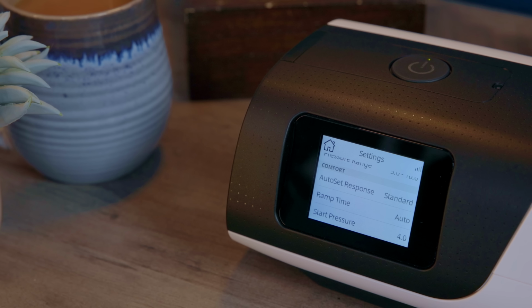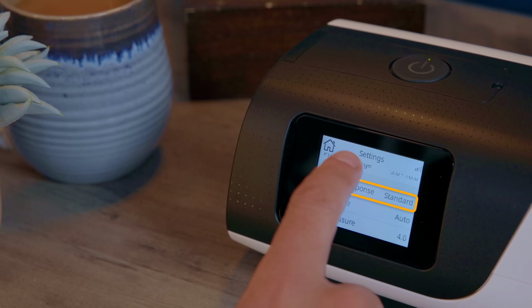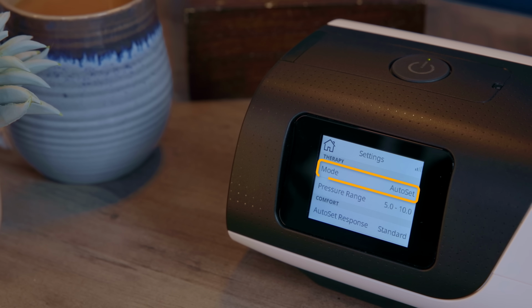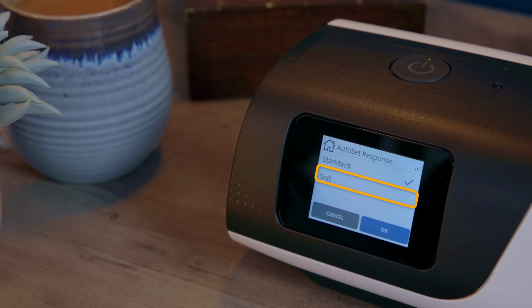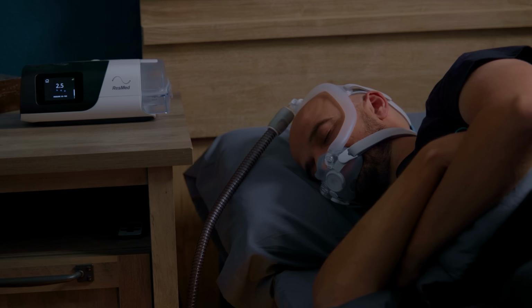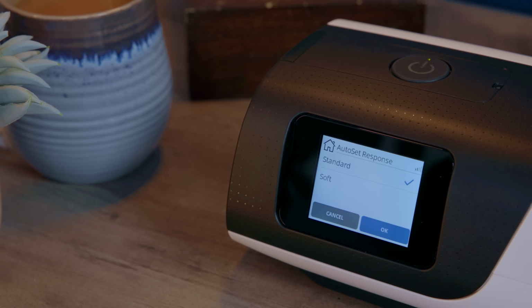The first setting here is AutoSet Response, so long as you have your machine set to the AutoSet mode, which will be most people. AutoSet Response is not in the normal My Options menu. It has two options, Standard or Soft. Standard means that the algorithm will increase and decrease the machine pressure at the standard rate, which is designed to maximize therapy outcomes. But Soft will make those same pressure changes, but more gently, and therefore trade a bit of effectiveness for more comfort. Since you're looking for comfort right now, consider putting this into Soft mode to smooth out those sudden changes in pressure during the night.